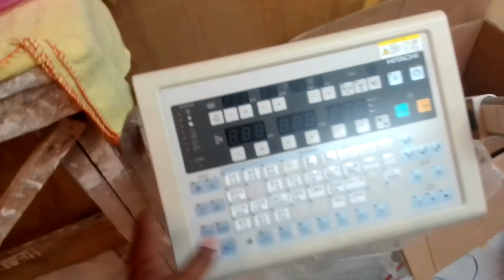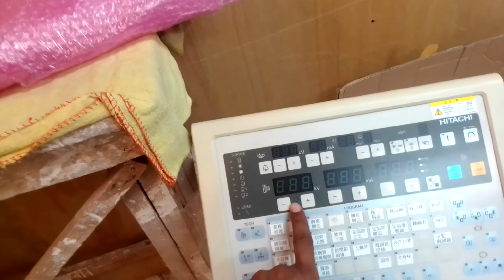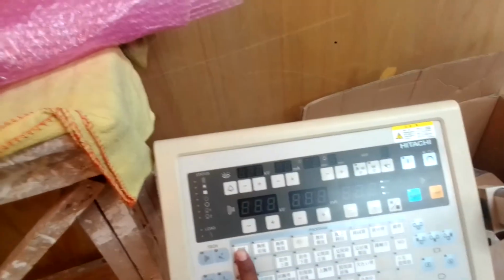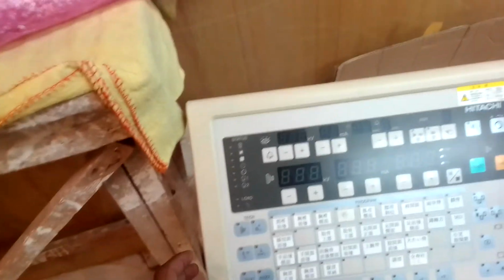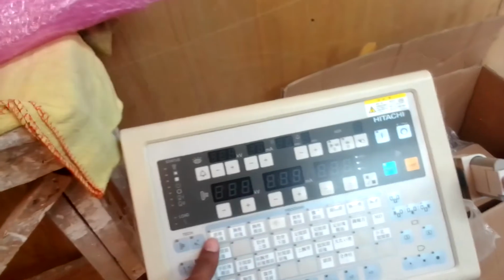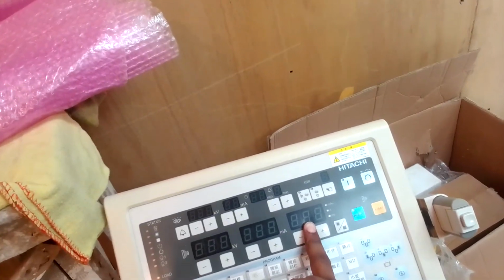This is the console of the X-ray machine. Before starting the exam you can set kV, how much kV you want to give to the tube. Here from this you can select. This machine has a maximum of 500 mA, okay, and 163 kV. 163 kV equal to 500 mA, but there are very rare chances to set 500 mA and 163 kV. But this is the console, and from here you can set kV, here you can set mA, and here you can set the time of exposure.